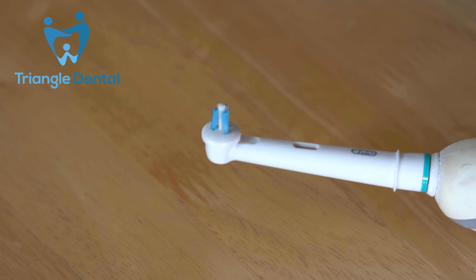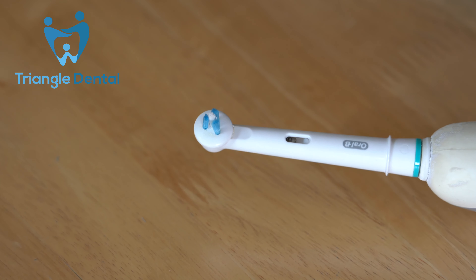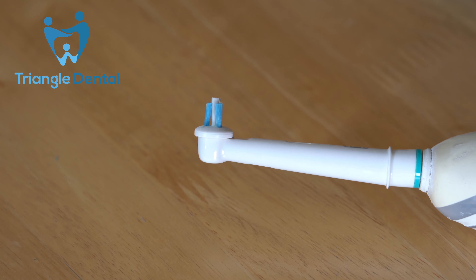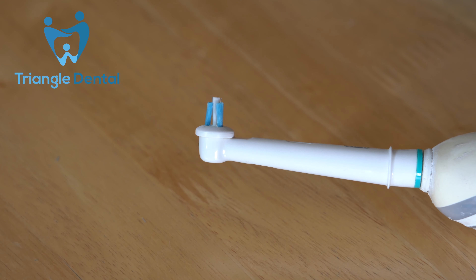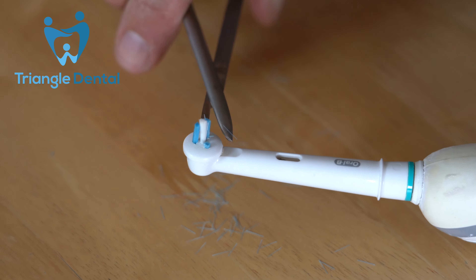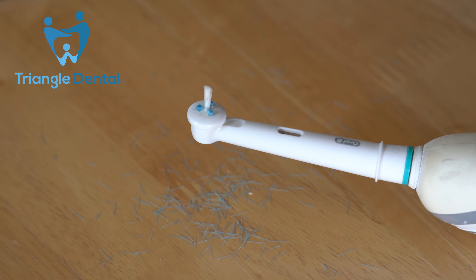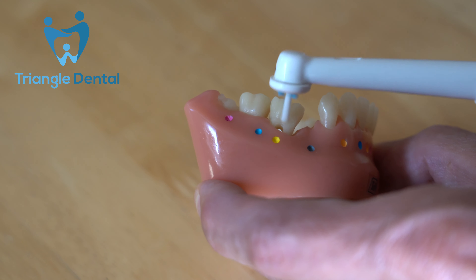If you have an electric toothbrush, you can use the electric interspace head to clean down the gum pockets. The main electric brush we recommend is the Oral-B, and the head rotates — having a rotating brush going down the gum pockets cleans really well. If you get the Oral-B interspace head, what we'd like you to do is cut off the blue bristles to make it smaller, so with only the white bristles remaining, the head is slender enough to put right down those gum pockets and really clean inside those gums.